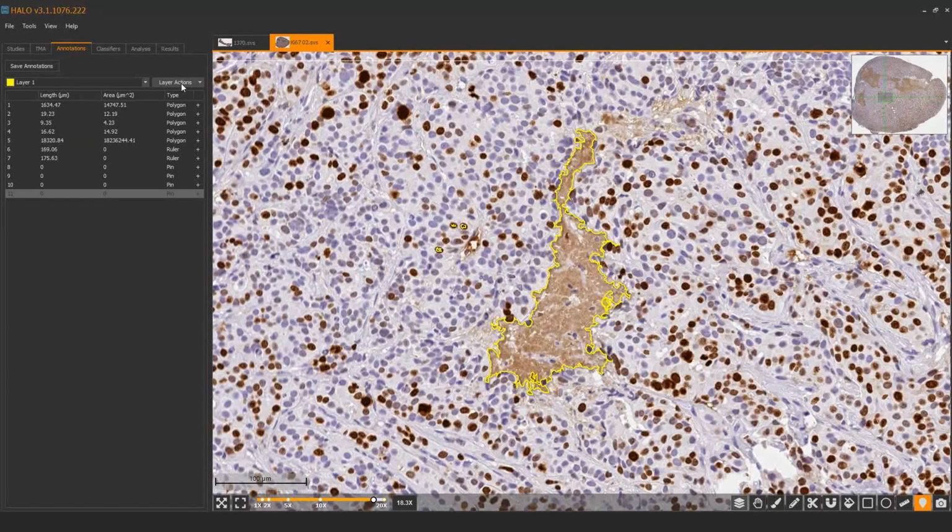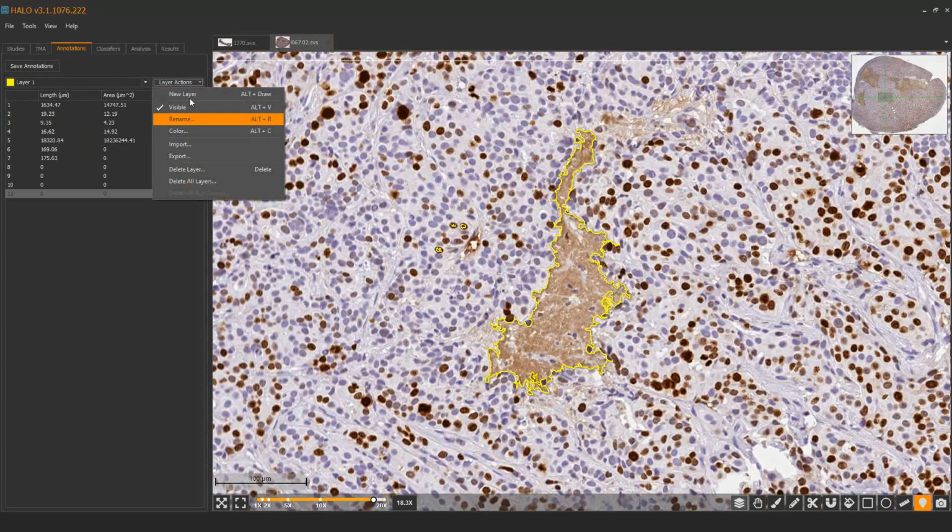So firstly, you'll see here you've got this layer 1 naming convention. You'll be able to make multiple layers of annotations, and those can be processed in batch. So if you had a tissue with multiple structures, maybe a section of brain, you could then create layers for different regions. Those can be analyzed separately, sequentially, so in batch, but all the same separately, and you can look at how many positive cells there were for different layers.